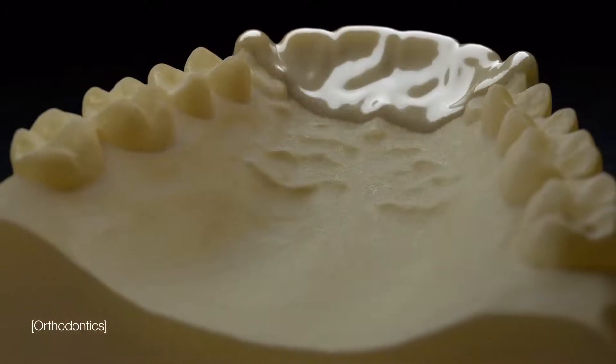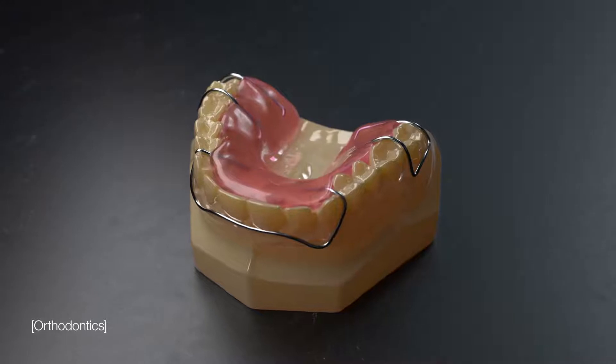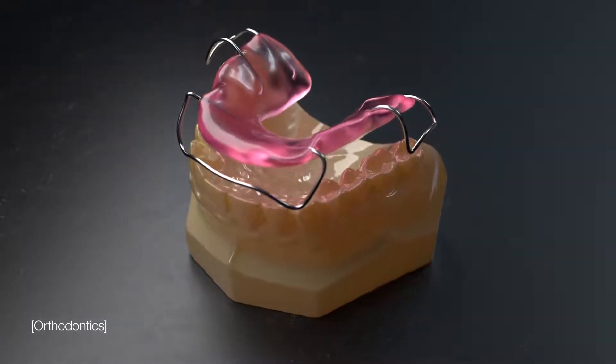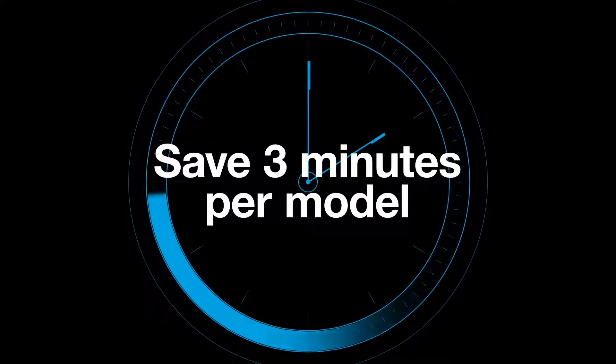Our unique separator digital material coats models in print, minimizing post-processing time and making acrylic and wax removal easy, helping to save up to three minutes per model in manual labor.